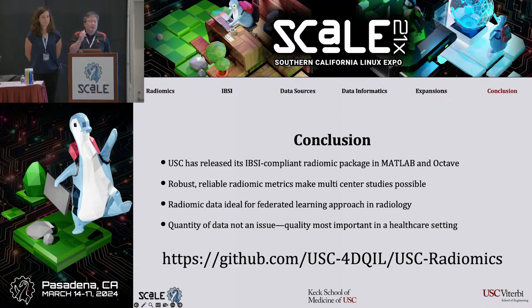Okay, so if you're doing ejection fraction, part of that is something these methods can be applied to. For example, in terms of what we're saying about quantification, most of the time with ejection fraction you're just measuring a volume and trying to see the different volume at the different phases of the heart. Keeping track of that information is becoming more and more prevalent at medical institutions, where they want to see how that progression is going. You can do this. The difficulty with standard images like that is this is probably more useful for disease states that are kind of static, like tumor analysis rather than functional analysis. But we are doing work with structural differences, and that might lend itself to things like taking the contrast inside the heart and seeing how it's shaped and how that changes shape. Maybe that's something we'll look at in the future.